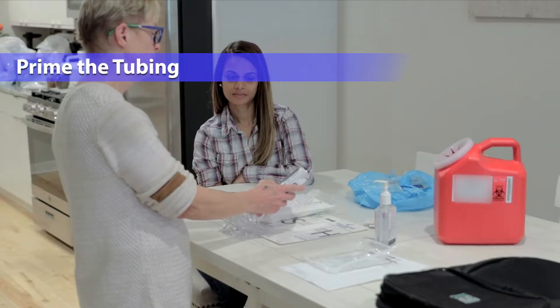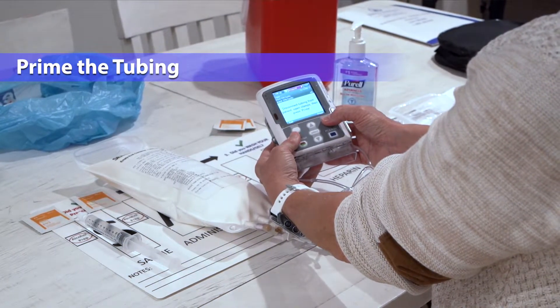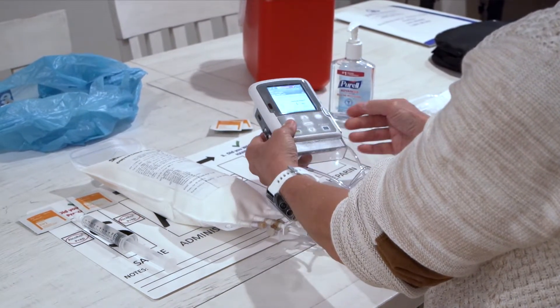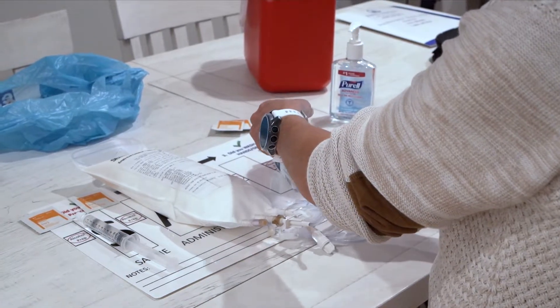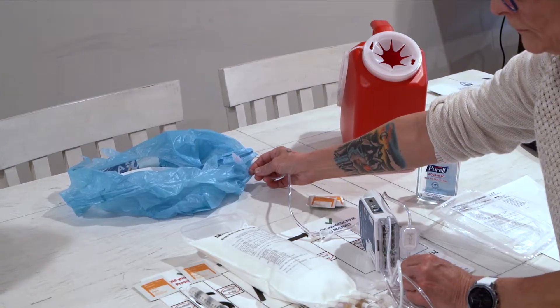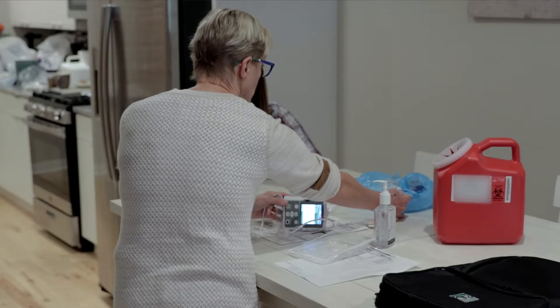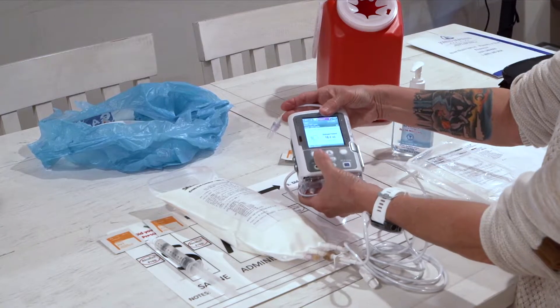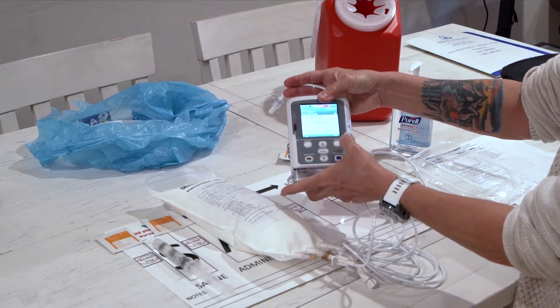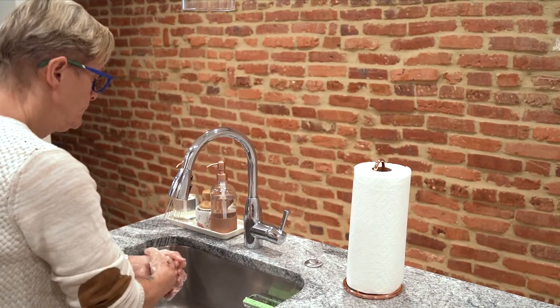Now prime your tubing. The pump will prompt you to prime. Place the pump on its side with the door latch facing down. The screen will say 'prime tubing' — select yes. The screen will remind you to be sure the tubing is disconnected. Make sure the tubing is disconnected and select prime. Hold the end of the tubing over the trash bag without allowing the tubing to touch the trash bag or anything else. When fluid starts to run out the end of the tubing, select stop priming. If the pump asks you to reset the reservoir volume when turned on with a new bag, select yes. Wash your hands again.